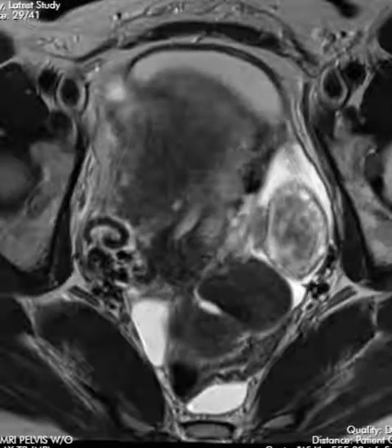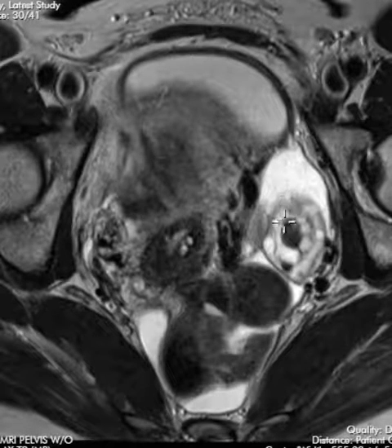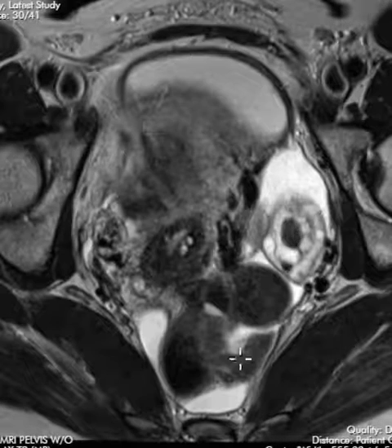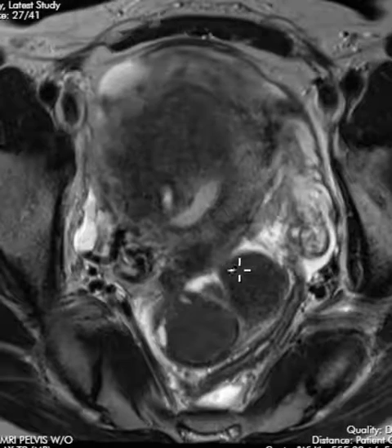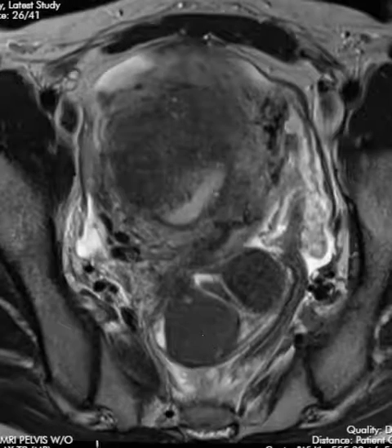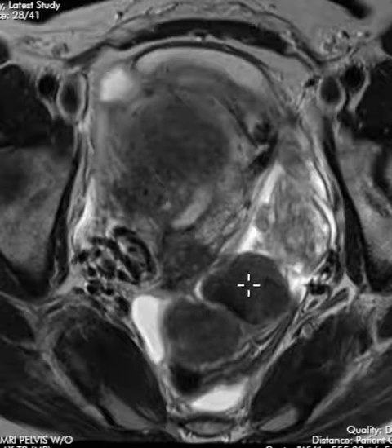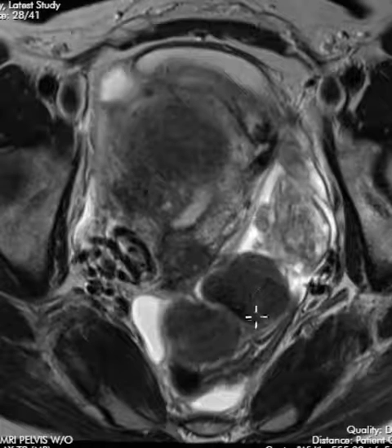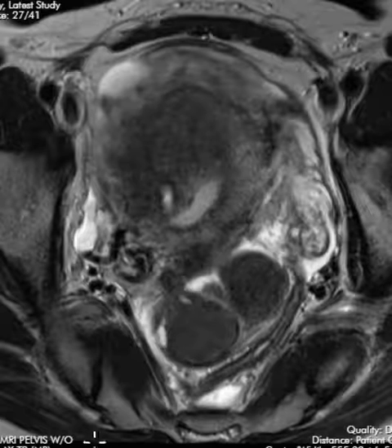This is the left ovary over here — you can see this area of darkness within it and some cystic changes. You can see other areas of darkness here and here. These are proteinaceous complex chocolate cysts associated with endometriosis.